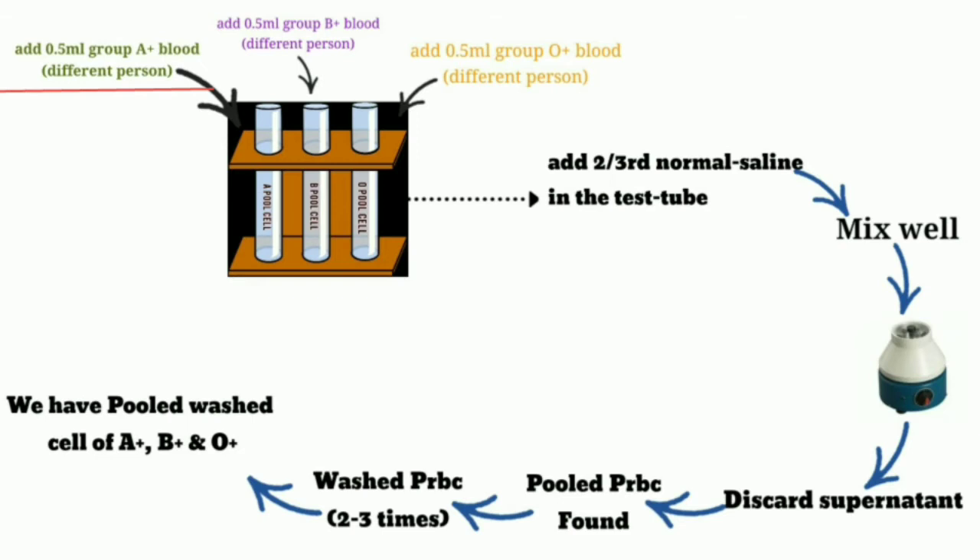Just like that, in the B pooled cell test tube, we add 0.5 ml of B positive blood from 3 different persons, so the total quantity of the B pooled cell test tube is 1.5 ml. Just like that, we add 0.5 ml of O positive blood in the O pooled cell test tube, so the total quantity in the O pooled cell test tube is 1.5 ml of blood group O positive.